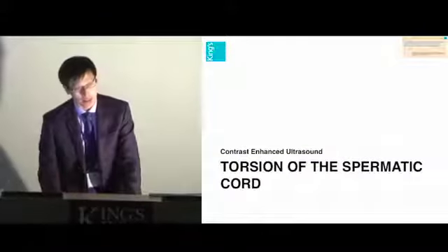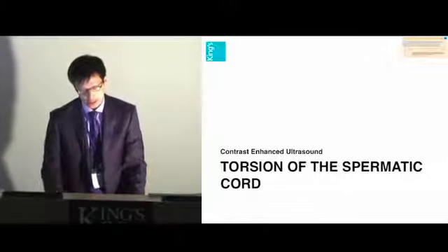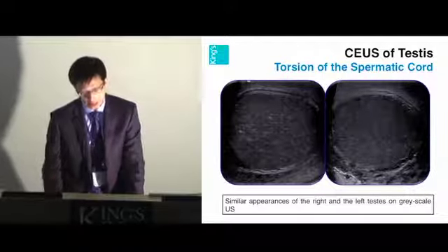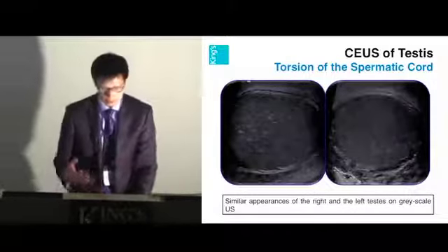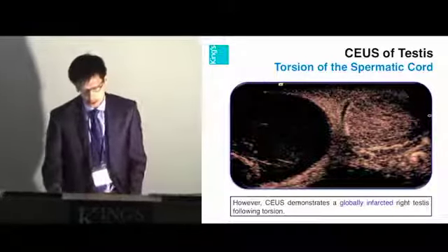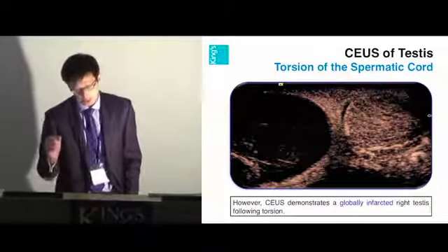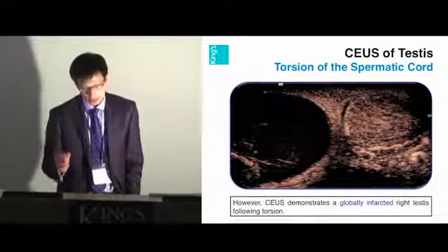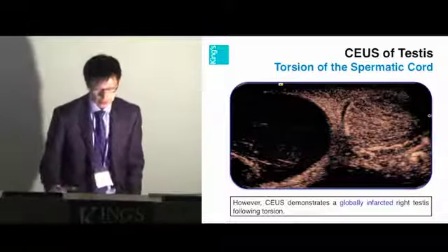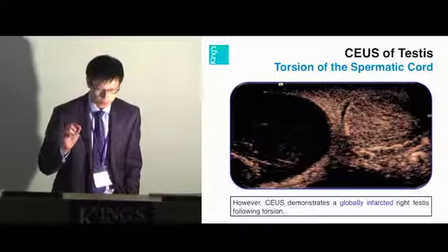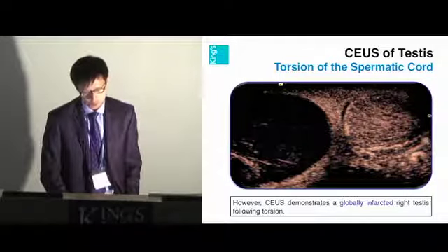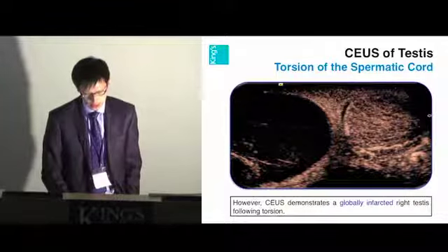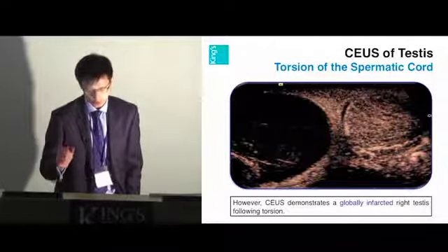As an example of how contrast ultrasound is used in determining vascularity: on B-mode ultrasound there may not be any striking apparent difference between the two testes. But on contrast ultrasound, it clearly shows there is no vascular flow within the right testis, confirming a global infarction. This highlights the use of CEUS in assessing vascularity where gray-scale ultrasound appears apparently normal. Color Doppler may identify lack of flow, but CEUS shows the distinctive lack of blood flow much more obviously.